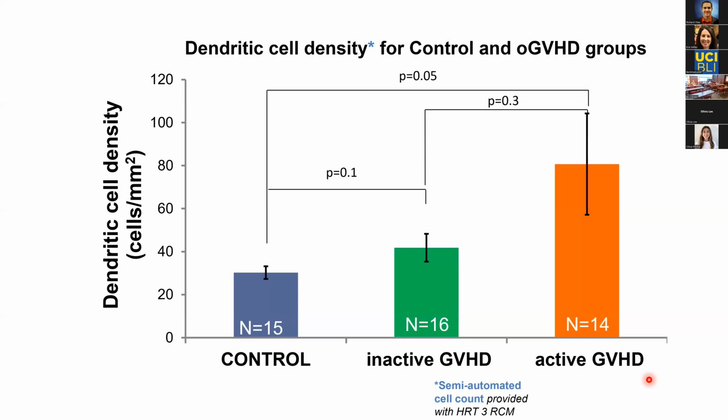I think that my diagnosis of whether it was clinically active or inactive was based on the patient's symptoms, the exam. But as I showed you previously, the exam we do with the slit lamp is very big picture. You know, I'm looking at, is the eye red? Is there fluorescein staining on the cornea? But I can't see what the confocal can see. I cannot see individual inflammatory cells, much less can I quantitate them at the slit lamp. So I will come back to that concept later.